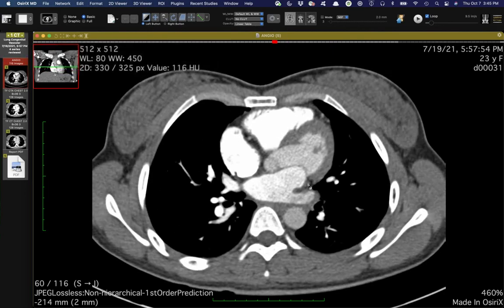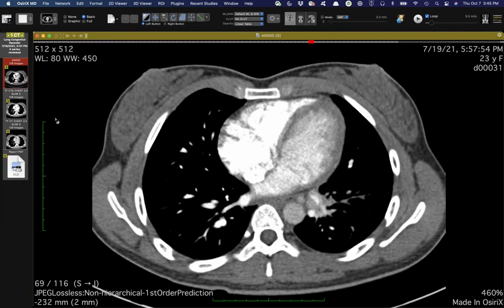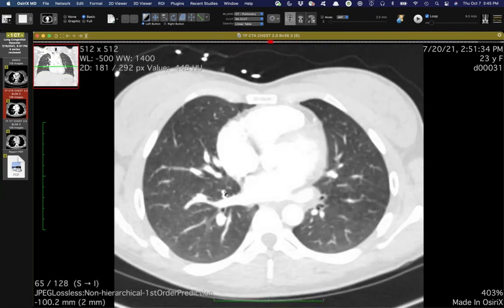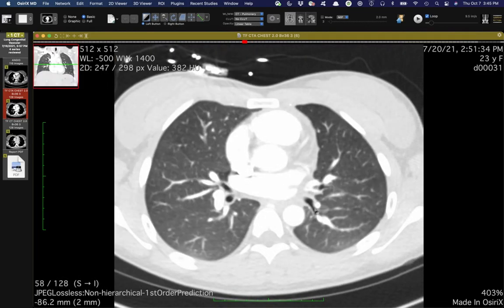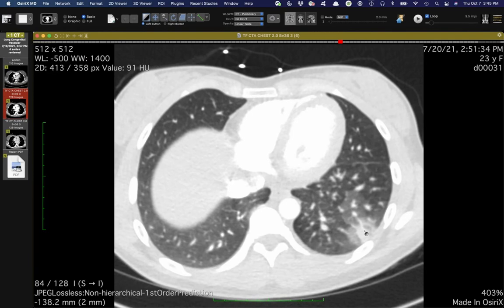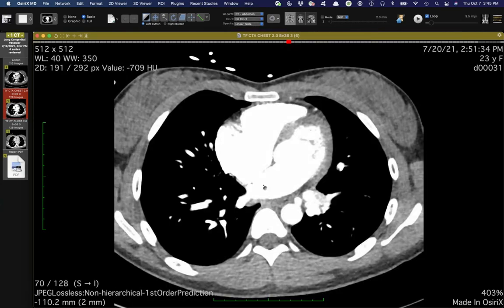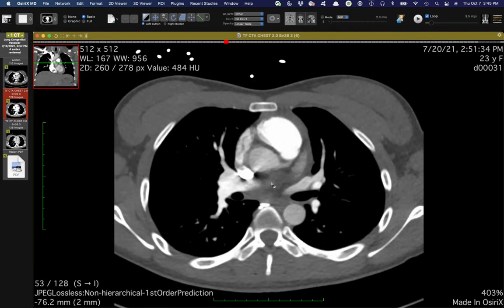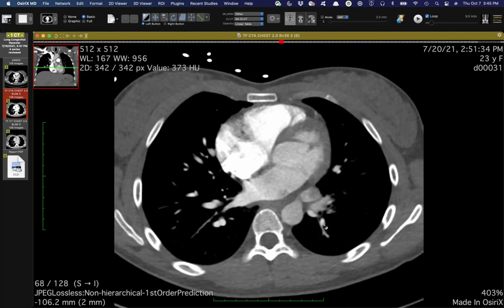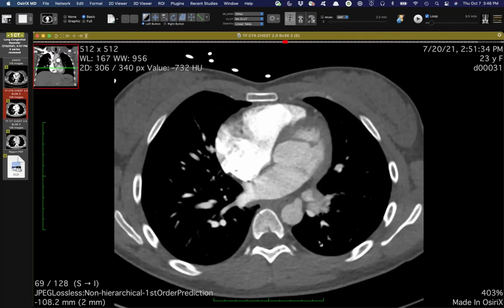I think we can explain why the left inferior pulmonary vein is less opacified, because most of the blood is being derived from a systemic source. When they did a repeat angio, I'll show you the lungs first. The bronchial branching pattern is normal. There's a superior segment, and then basilar segments that all communicate with the airways. Presumably this is the site of her hemorrhage in the left lower lobe. Looking at the vessels, there's a pulmonary artery branch to the superior segment of the left lower lobe, actually this one right here, and then no other pulmonary arterial branches. The basilar segments are all derived from the aorta.